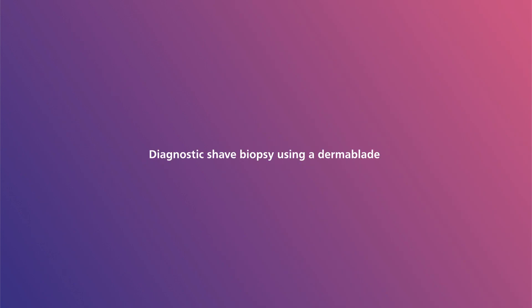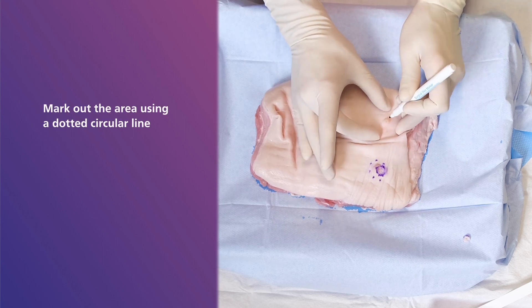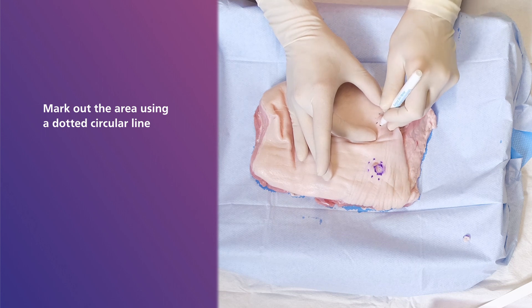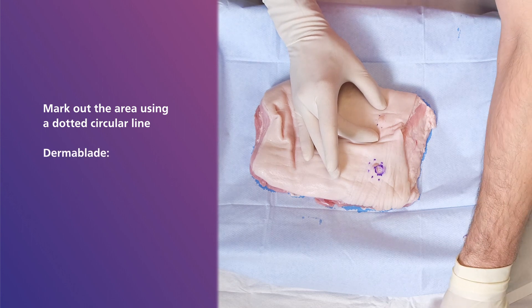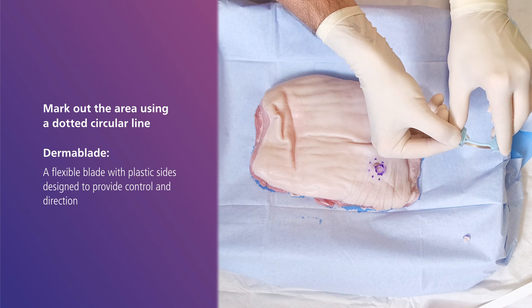Moving on now to the diagnostic shave biopsy using a derma blade. The area of concern is again marked out using a dotted circular line. This biopsy is performed with a derma blade — a flexible blade with plastic sides designed to provide control and direction. The depth of the shave biopsy specimen can be altered with more squeezing force on the side of the instrument, resulting in increased blade curvature.